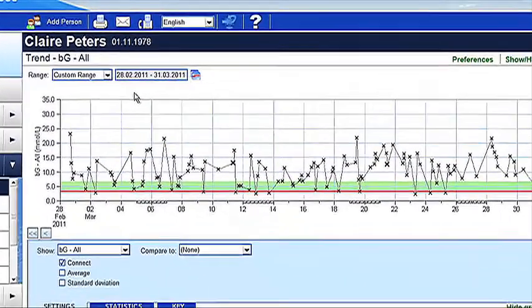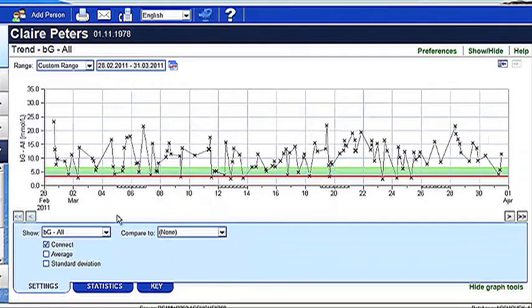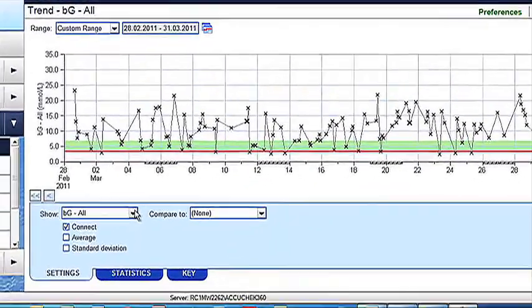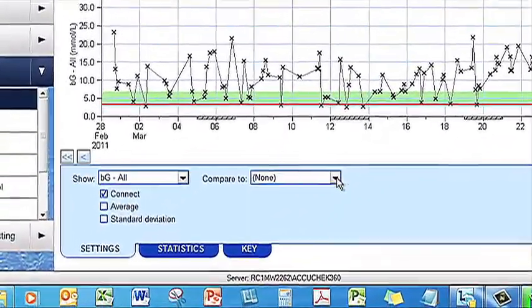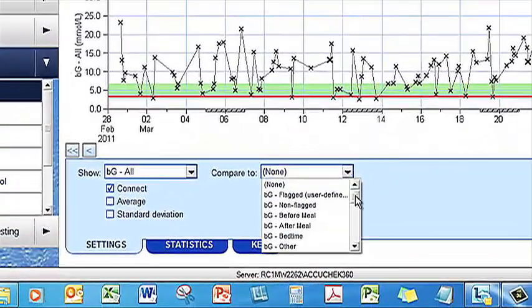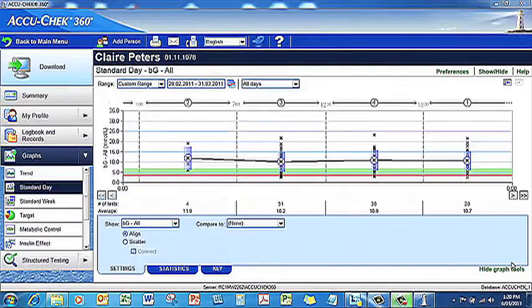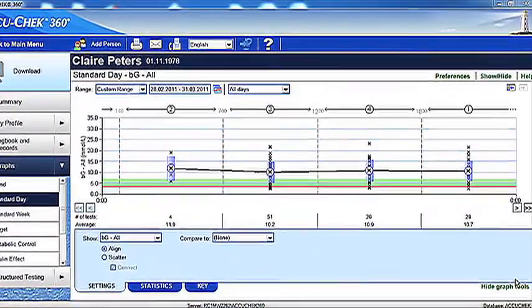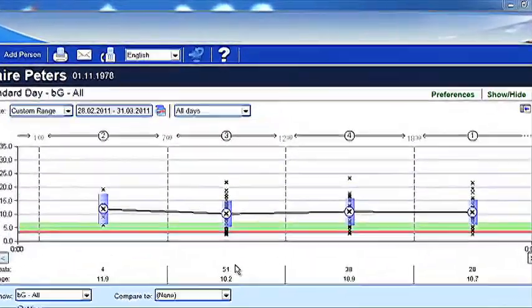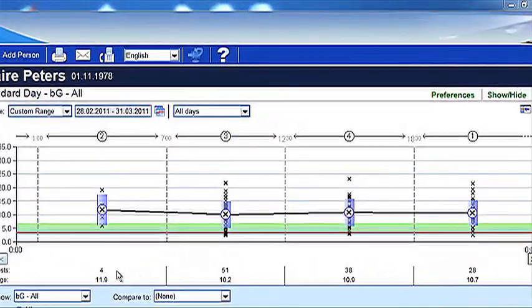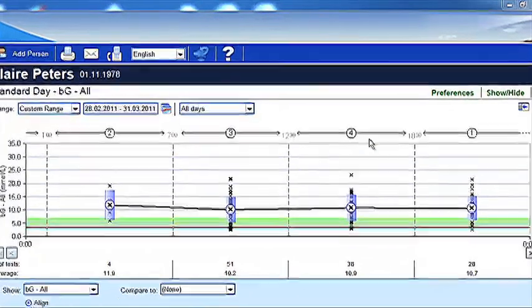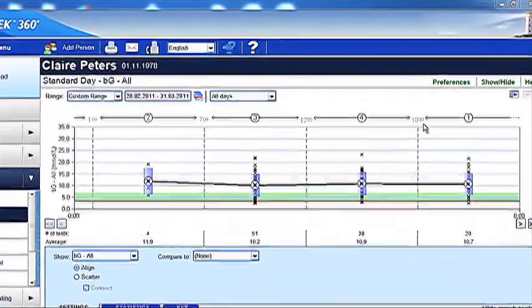You can also compare your blood glucose readings to other parameters such as insulin and carbohydrate intake. In the standard day graph, you can view your blood glucose trends over a 24-hour period, with your data being displayed based on your time blocks.